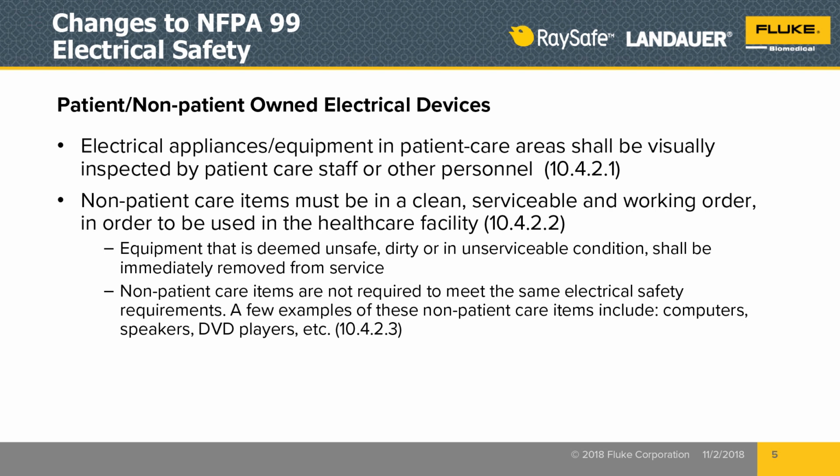Not only do we deal with medical devices in NFPA 99, there are specific points calling out also patient-owned electronic devices. So that might deal with somebody bringing a DVD player or something else. It's worth highlighting here that it's not just the biomed department that's responsible for ensuring that those devices are safe. There's actually a mandate that all clinical staff need to be looking at these patient devices, ensuring that they are safe, so they're clean, in good repair, the power cords aren't frayed. They're fairly basic things for visual inspection, but there still is that mandate.